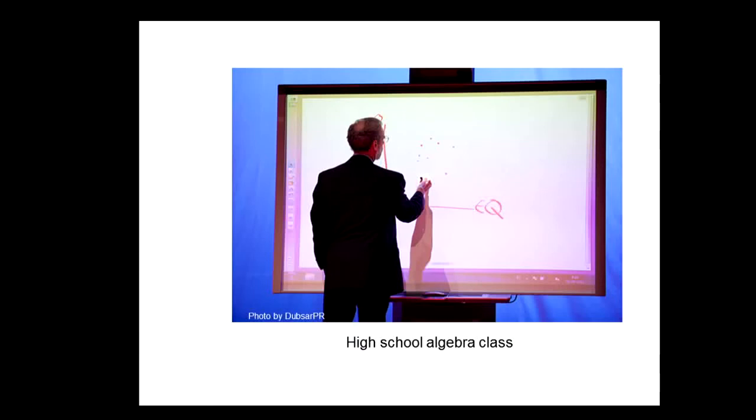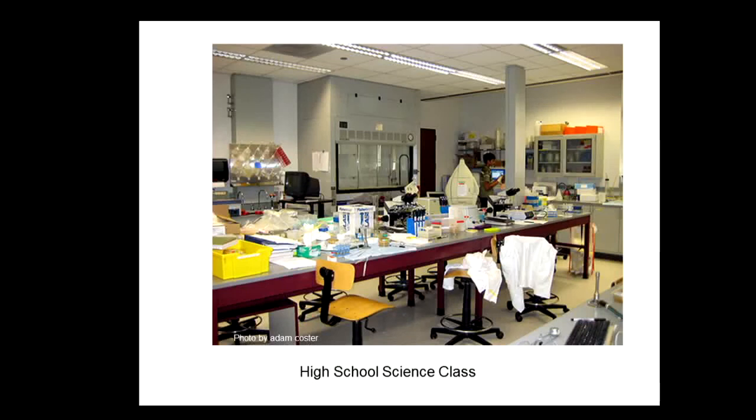Our next one is a science lab. And often, because those rooms can be very large, there can be dim areas of the room or items that you need to have caution around them, glass beakers, things like that. So it's helping the student become familiar and identify when their devices can be useful in those settings.